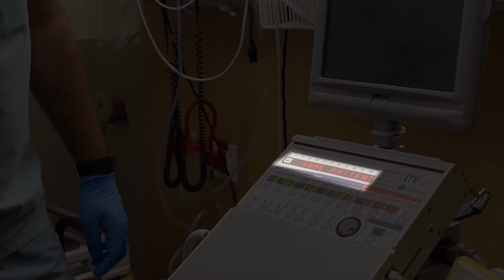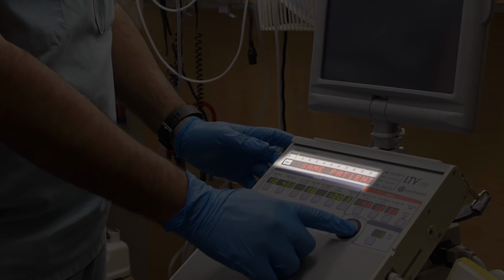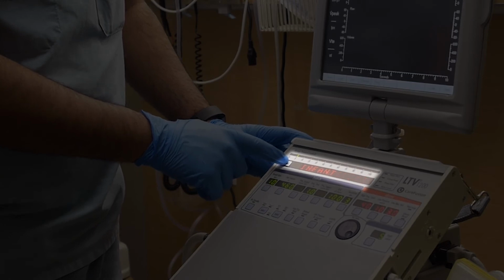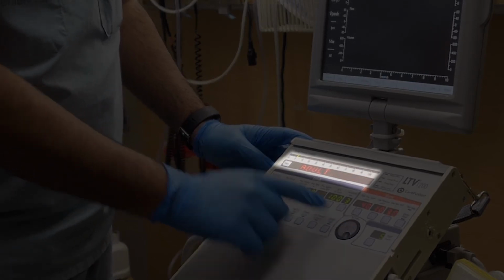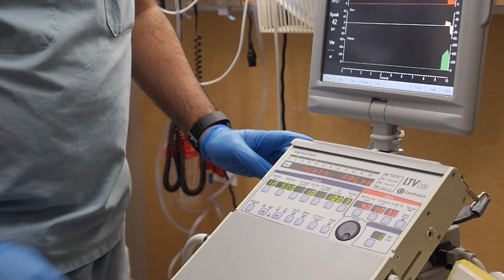The ventilator is now simply asking you to describe your patient before setting the parameters it needs to breathe for them. Once you see Same Patient on the monitor, use the dial to scroll to New Patient, and then press the Select button. It will say Infant. Use the same dial to rotate past Infant and Pediatric to Adult, and then press Select. You are now ready to set the vent.